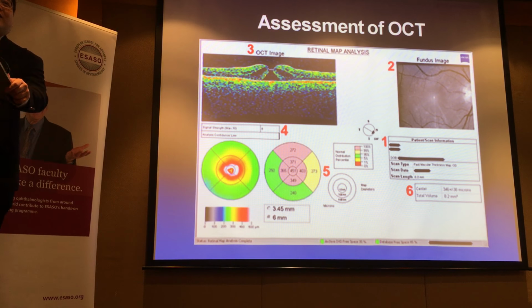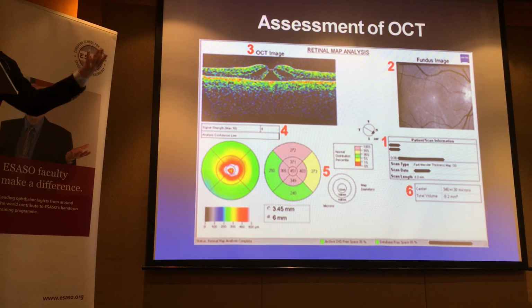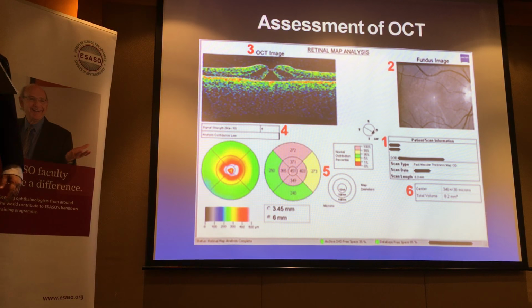Okay? And if it's an ophthalmologist seeing me for a retinal problem, I'll try to refer him anyway to Adrian or something. So what patients want is they just want this thing to show them, keep for their records or to show their relatives, which is perfectly fine. But for ourselves, as ophthalmologists, it would be important not to just rely on this. Right? And that's one of the things I will come back to.